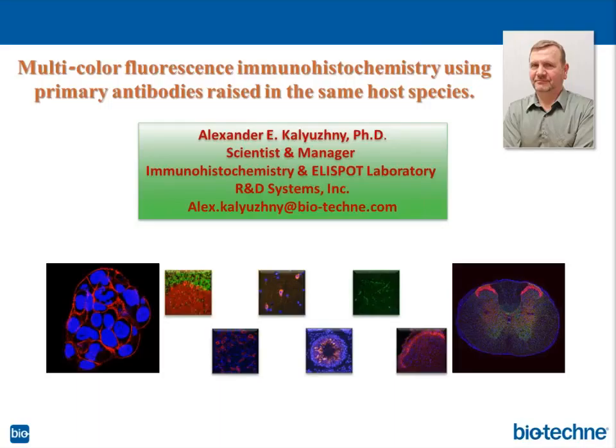Let's put it this way: no matter how good the washes are, you may get association and interaction of secondary antibodies with irrelevant primary antibodies. We checked it many times, and it may sound illogical that, if we do all the washes, we should get rid of all these non-specific sources of signal, but somehow it's not working, and the secondary antibodies will find their way to irrelevant primary antibodies. So it's not a good way of doing it.